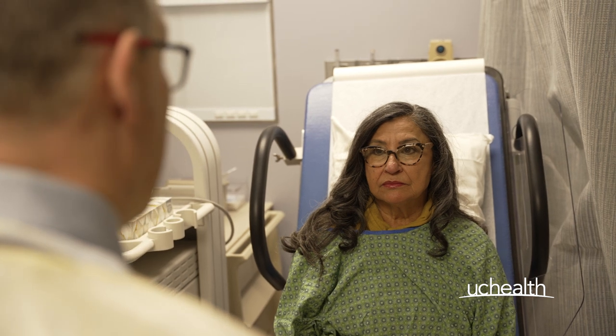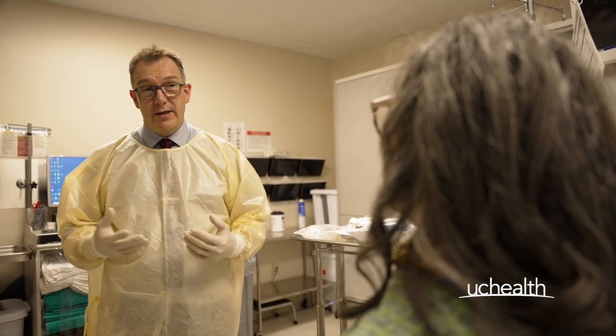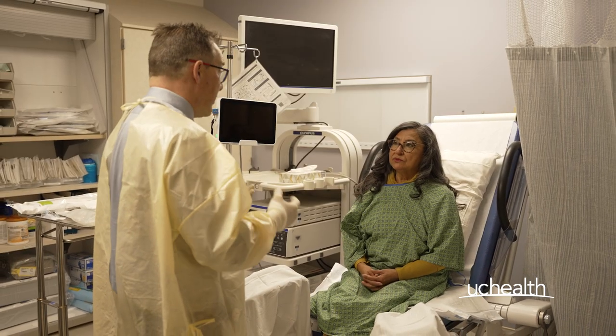Sometimes when we fill the bladder, you might leak water. That's okay because that's our water, not your water. Cystoscopy is really well tolerated by patients. We're very careful to make sure that you're as comfortable as you possibly can be. We give you local anaesthetic so that we numb the area. There will still be some areas of discomfort — we'll talk you through those.